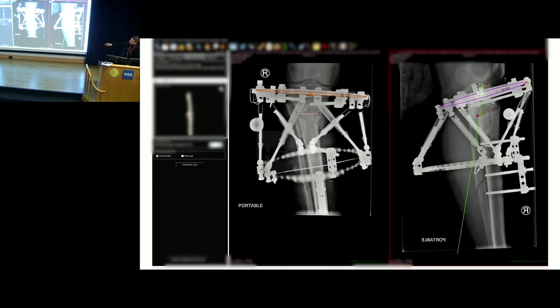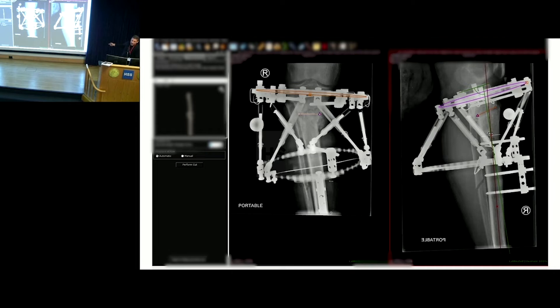It has all the Paley-Tetzworth orientation angles. We're dropping down an 81-degree PPTA and then generating a line distally — this is just an anatomic axis line. It will then generate the CORA on the lateral, or the apex of the deformity on the lateral, as well as the magnitude of the deformity.